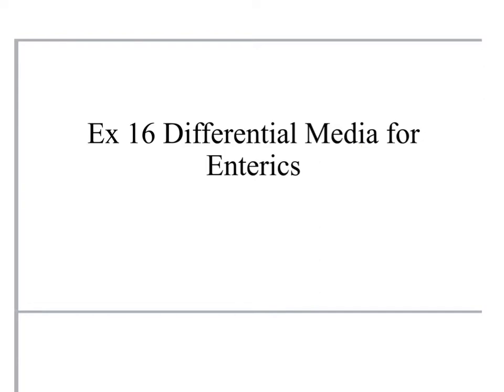You're going to be thinking about gram-negative identification here in this lab. Okay, so if you look at page 70 on your data table there of your lab book, you'll see the 10 organisms that you are going to learn to distinguish between in this lab and the next one, exercise 17. Okay, so what do all these organisms have in common? They are all gram-negative, rod-shaped organisms.